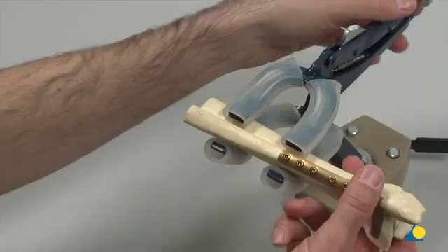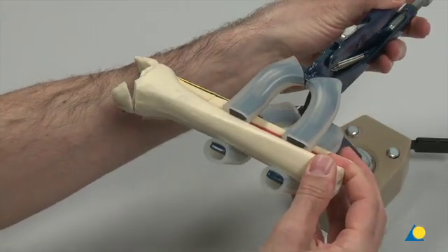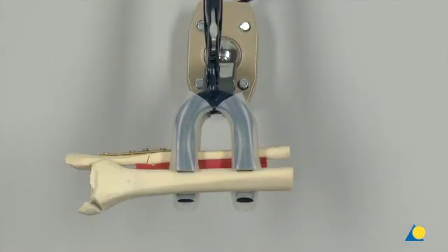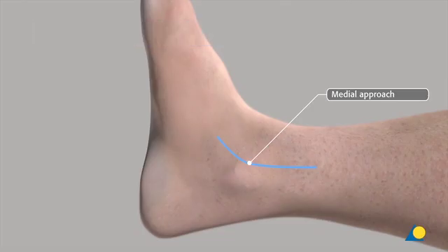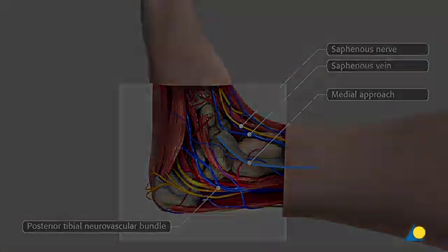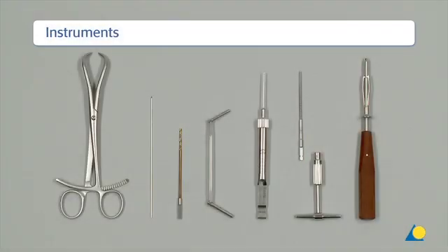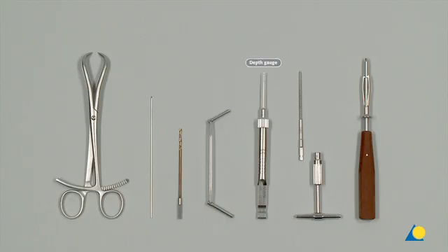To facilitate access to the medial malleolus, the bone model is rotated 180 degrees. The next step is the reduction and fixation of the medial malleolus. On the medial side, the approach is made through an anteriorly curved medial incision on the medial malleolus. The posterior tibial neurovascular bundle must be respected, and the great saphenous vein and the saphenous nerve lie anterior to the incision. The required instruments include the large pointed reduction forceps, the 1.6 mm K-wire, the 2.5 mm drill bit, the 2.5/3.5 mm universal drill guide, the depth gauge, the 4.0 mm cancellous tap, and the hexagonal screwdriver with holding sleeve.